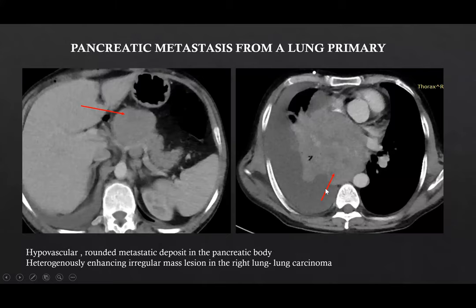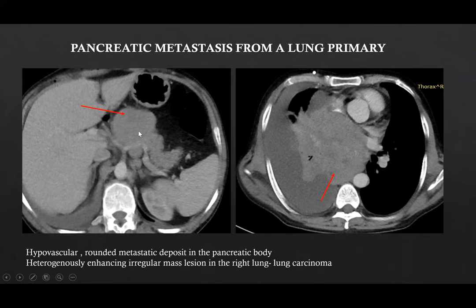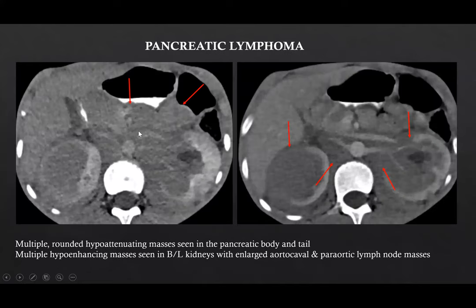This was the case of a pancreatic metastasis from a lung primary. Here we can see a heterogeneously enhancing mass lesion in the right lung along with a hypovascular rounded metastatic deposit in the pancreatic body. This was the case of pancreatic lymphoma where we can see multiple round hypoattenuating masses seen in the pancreatic body and tail.